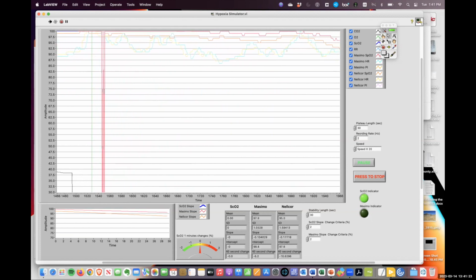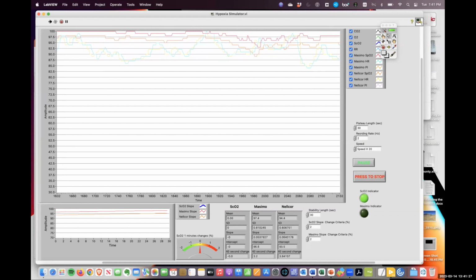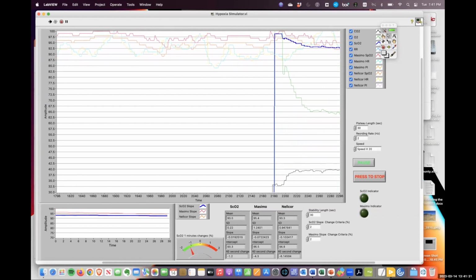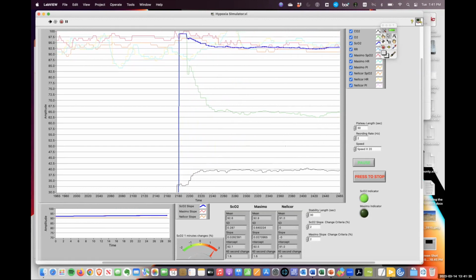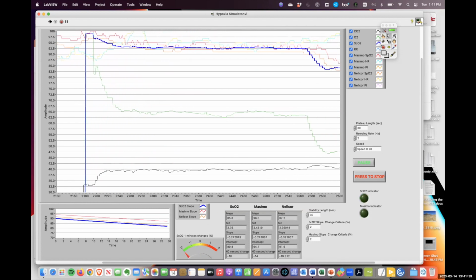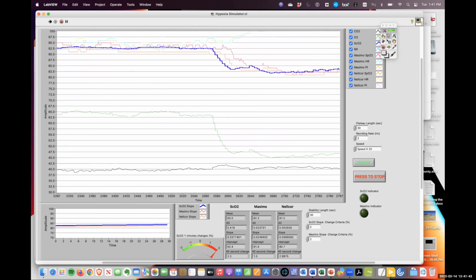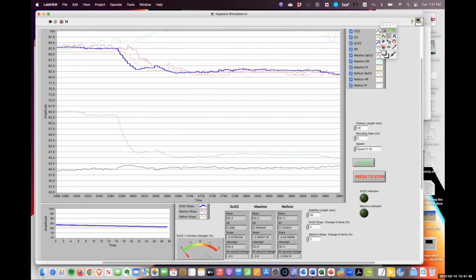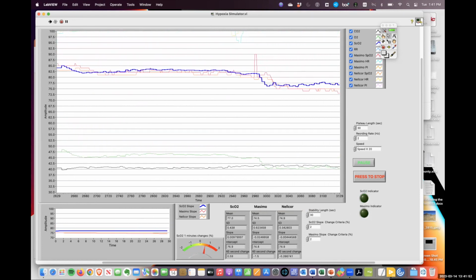And then we can start. There is variability as they're sitting here sometimes, partially from hyperventilation. We have a second run, nice and stable, heart rate goes back up. This is the CO2 down here, which is nice and stable. This is the O2. We have another run, good response, little instability at first, not unusual. We stabilize, hold it, draw multiple samples, final desaturation into the 70s.